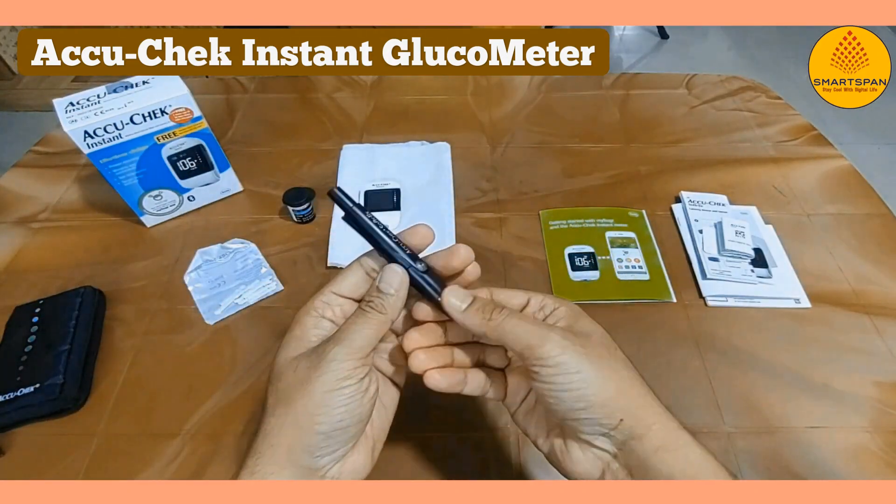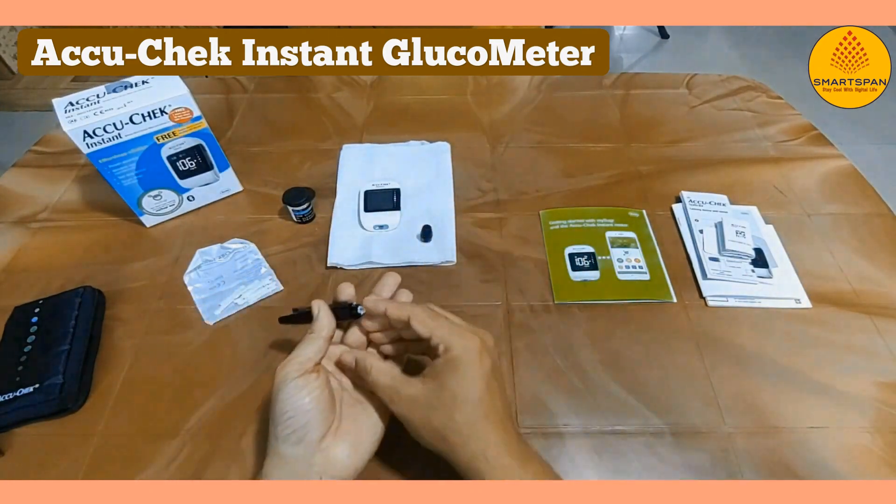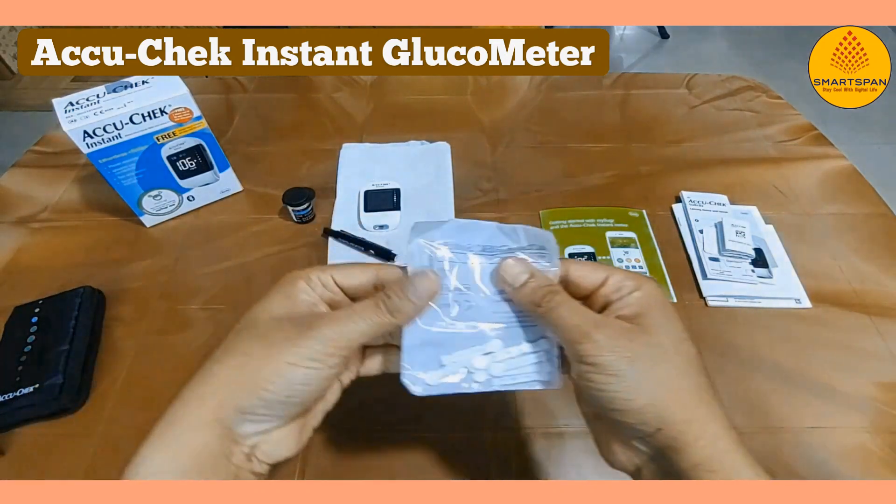Insert the lancet into the lancing device, adjust the depth if needed, and you're ready to prick your fingertip. Use the included lancing device to prick your fingertip.